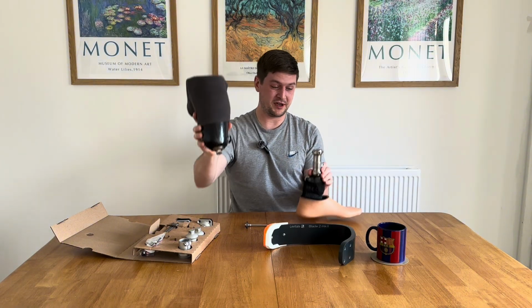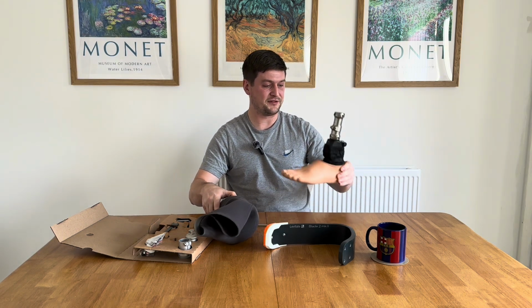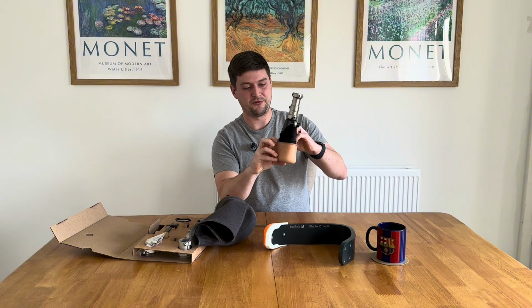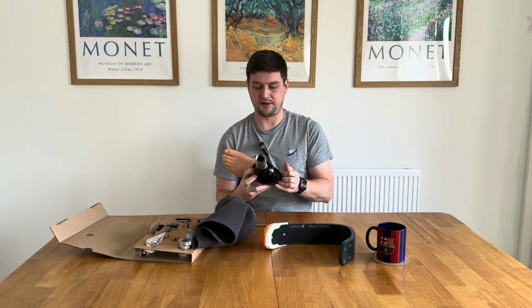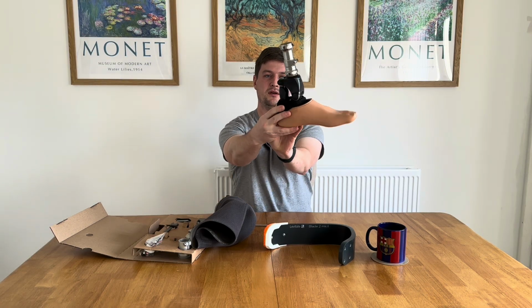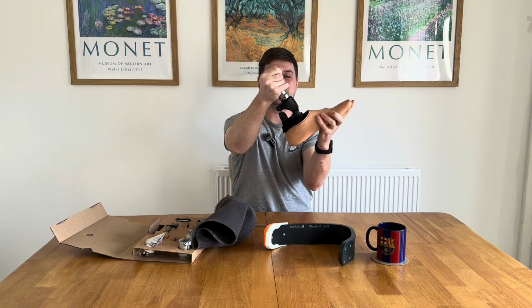So there's my socket, and there's my foot and ankle. That's very expensive, that's probably about £5,000 or £6,000 worth, which is crazy. And I'm really lucky that the NHS looks after us with stuff like this, but I couldn't get a running blade on the NHS, so I bought this myself. But look, I imagine that's to replicate your Achilles heel, and that linkage allows the foot to have a bit of movement in it.